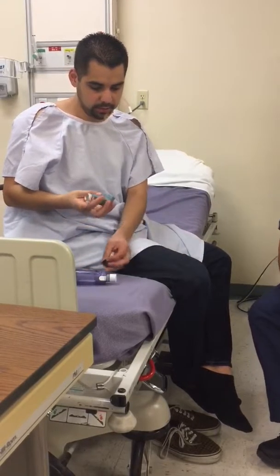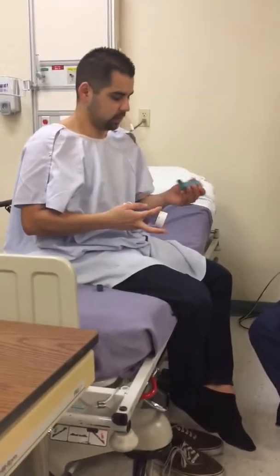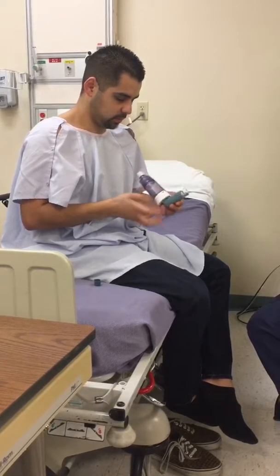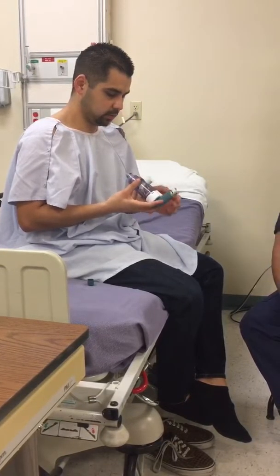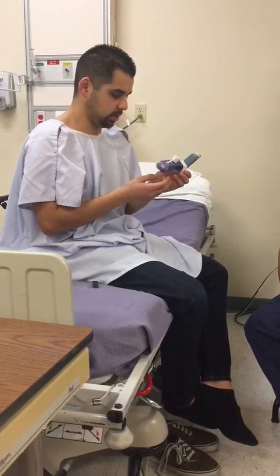Perfect. And then I don't put the cap back on, right? Yeah, exactly. Just go ahead and use the spacer. So that means the drug's ready, and then I can go ahead and put the spacer on. And then I take off the mouthpiece. And go ahead and actuate the device, so I have a dose there for you. So it has the drug ready.